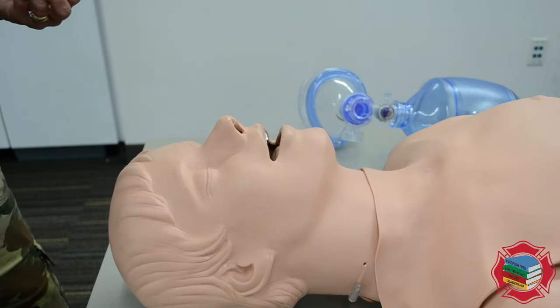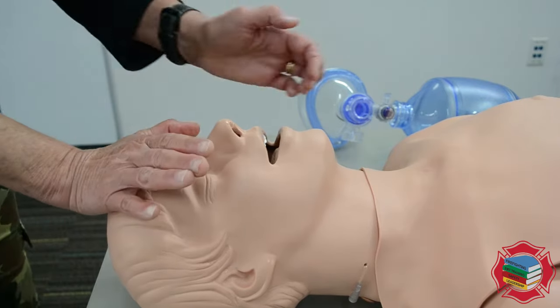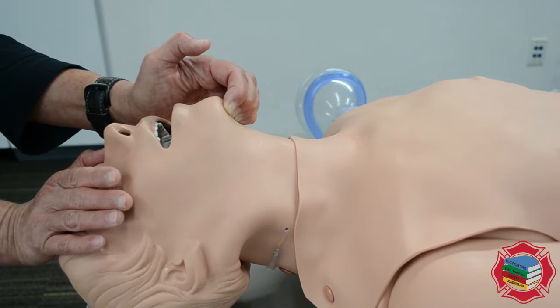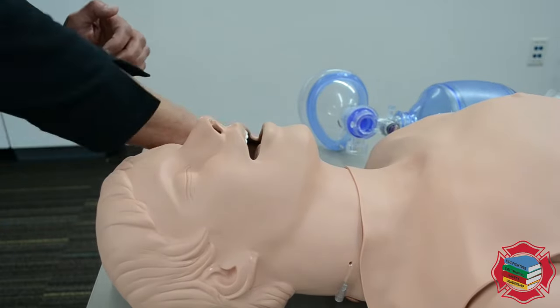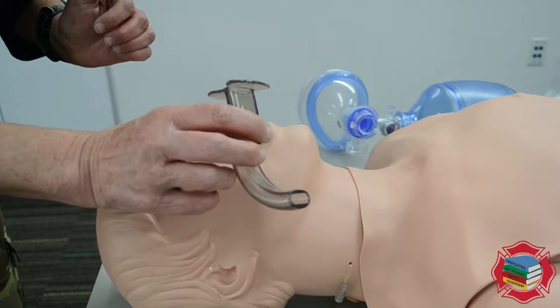This is for a patient who has a pulse but who is not breathing or not breathing adequately. I'm gonna go with a head tilt chin lift, being careful not to compress the tissue under the chin because that can occlude the airway.